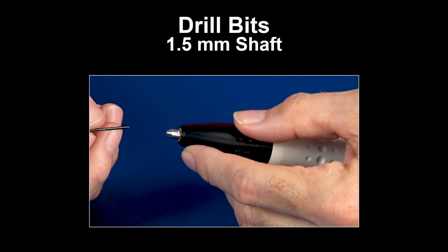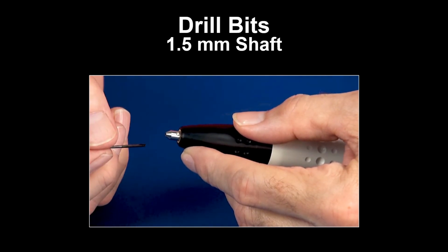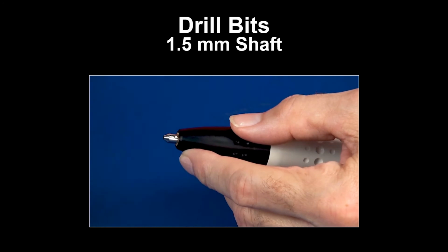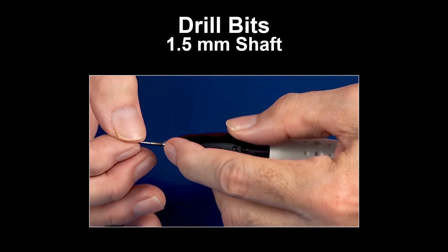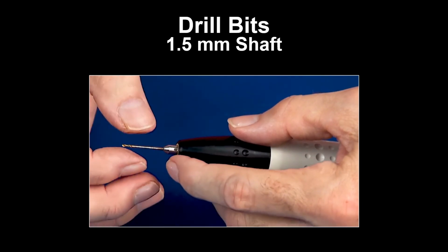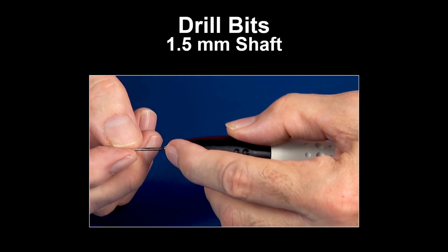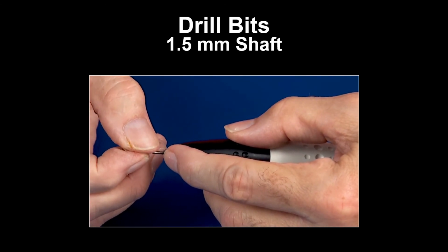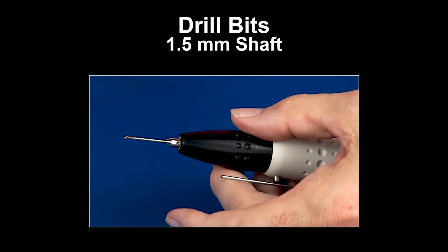Insertion of a 1.5mm shaft VetKISS drill bit into the micro drill. Note the cross pin off center in the drill. There's a corresponding taper on the drill bit, and the concept is to wedge that taper into the offset pin and feel that snug retention. To do that, one can visually line up the two and place that in, typically holding that. I felt it drop off, and I feel a resistance to drill bit extraction. Sometimes that feel is unclear, and what's easier to do perhaps is to intentionally put the drill bit in, orient it properly, stop rotation of the drill motor with your fingertip, and just simply walk that around until it falls off further and you see and feel that longitudinal placement and lock. Okay, and at that point the drill is ready for use.